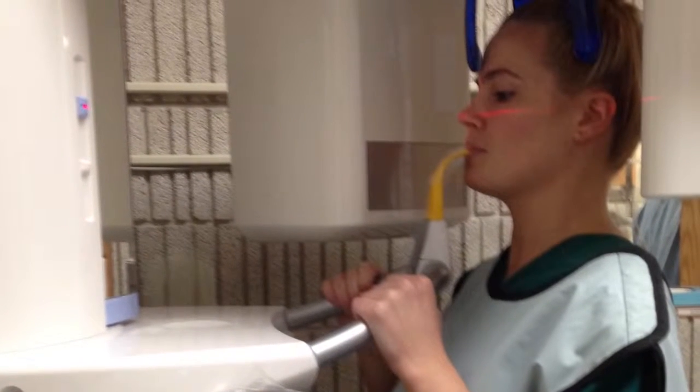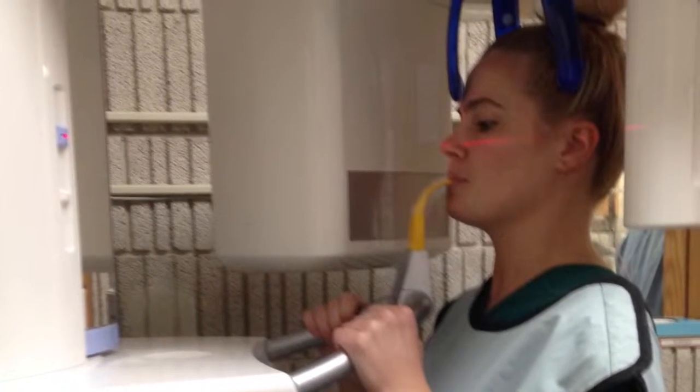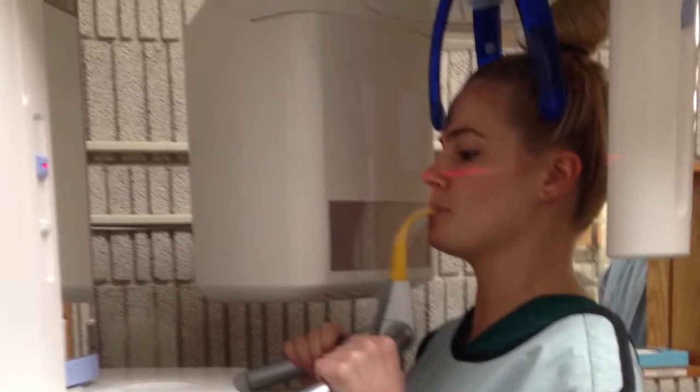The clinician instructs the patient to stand as tall as possible with a straight back and to bite on the plastic block. The ala tragus and mid-sagittal plane are properly aligned, and further instruction is given to the patient.